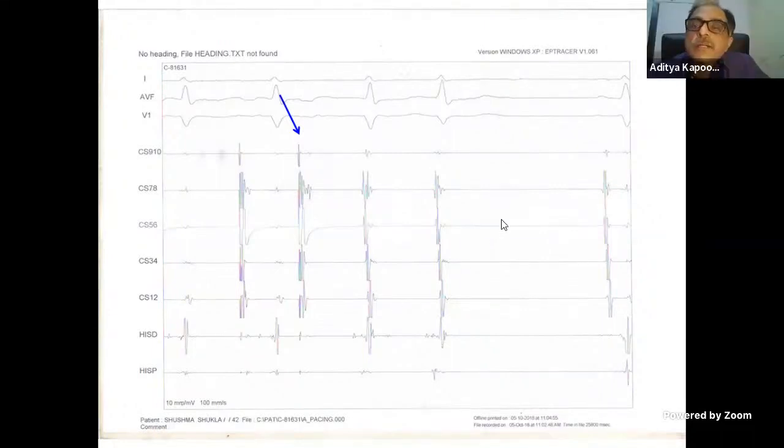So have you understood that? So you will get a V on A because the retrograde activation is very fast. And as sir said, you see the sinus beat. You can clearly see the A is like this. So in hindsight, this will be A only.